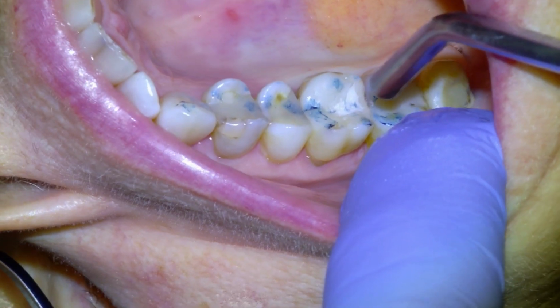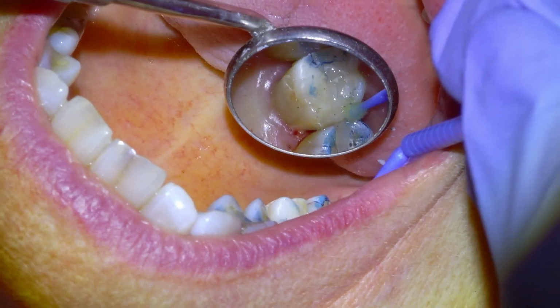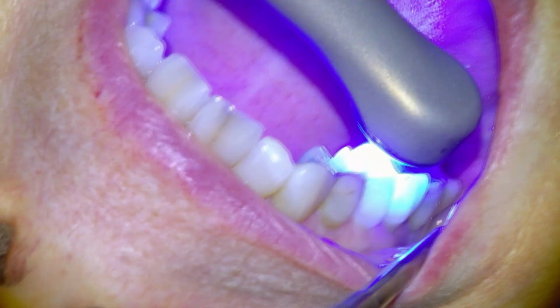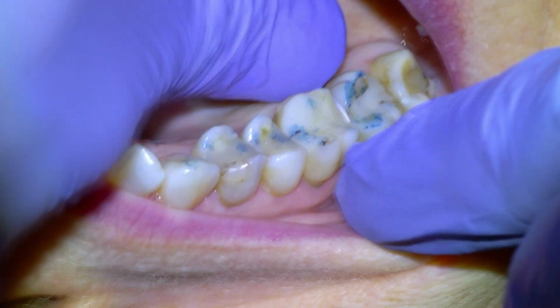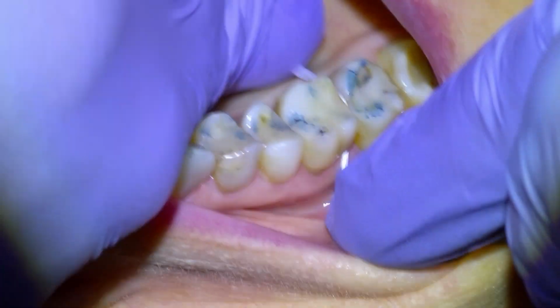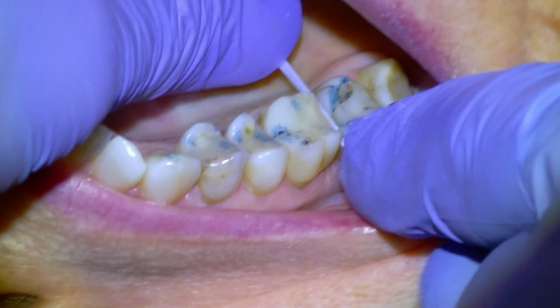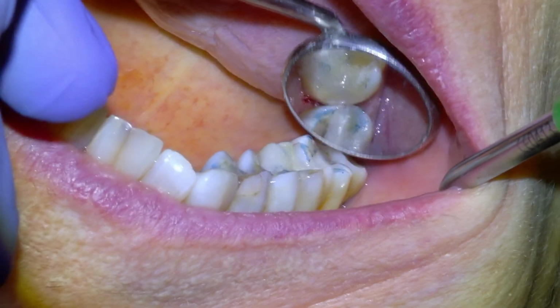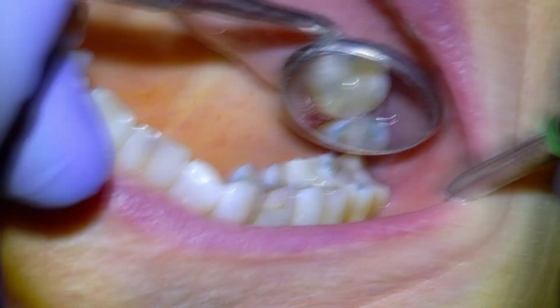We're gonna apply our coating agent to seal up the material and light cure that. This patient knows that this is a hugely restored tooth, and a crown certainly would have been ideal, but you know, this restoration is going to stop the decay from getting into the pulp, and honestly I wouldn't be surprised if it lasted for many years. Check the contact with some floss, and we're pretty much satisfied there.